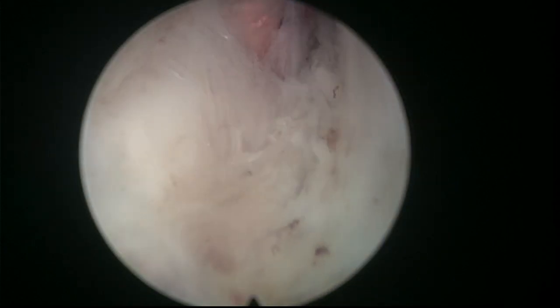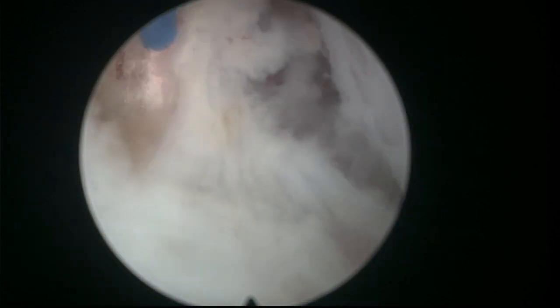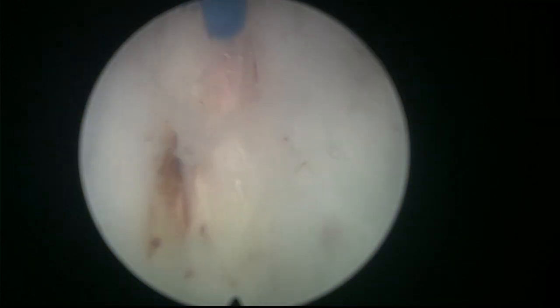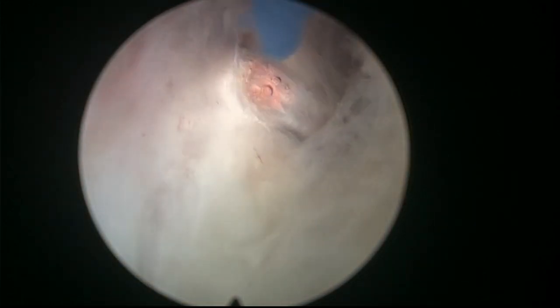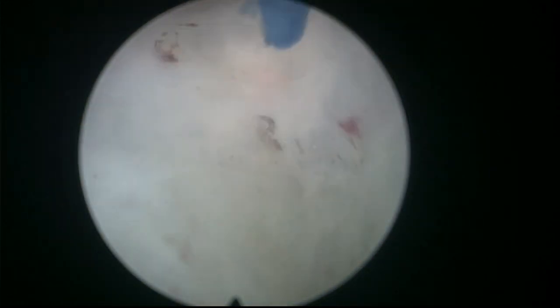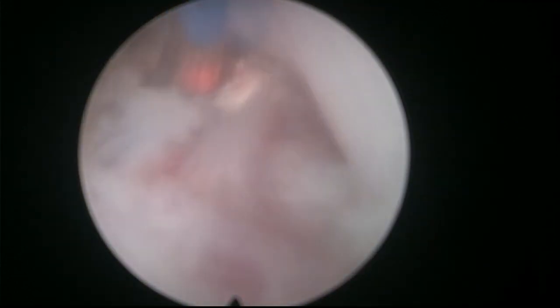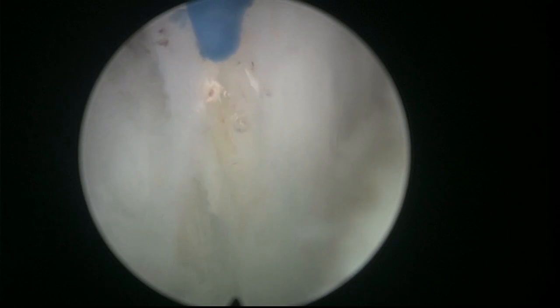I try to apply the same principle of liberating the apex early, and of course this white line idea, marking the apex and then releasing the mucosa early, I think it was very, very important. I thought maybe there is no way to do this apical liberation with a straight firing fiber, but the truth is I learned how to do that. And I think these cuts that we do in the apex to liberate the apex from the sphincter are very, very important to liberate the sphincter and respect it beautifully.